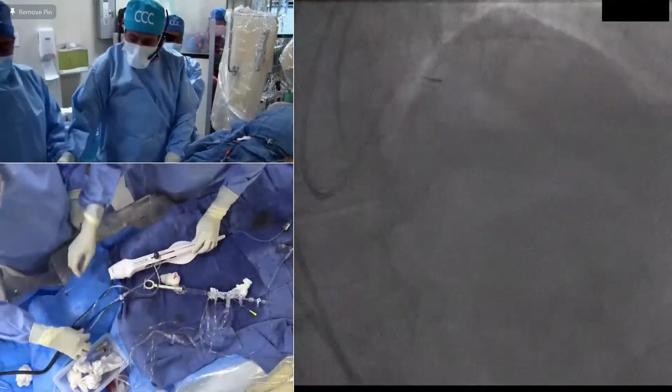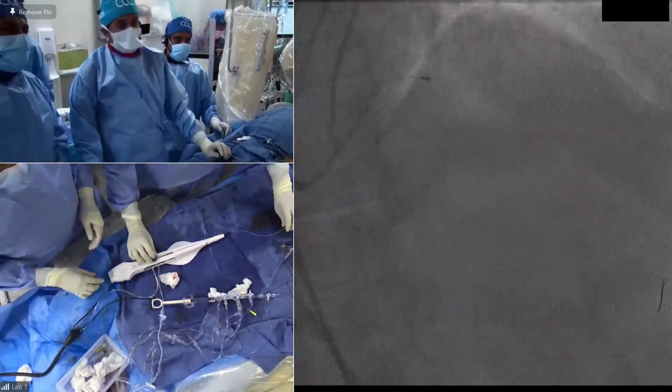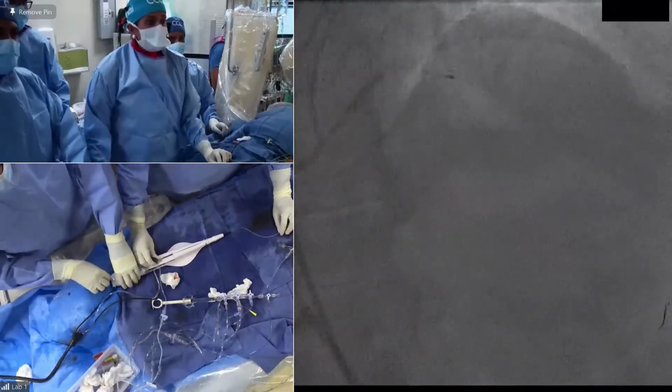Okay. So what we'll do is, once we have it, we'll dyna all the way down there. Okay? Good. Just why not burring? Yeah. We need to burr anyhow. Or start. Okay. You have to pull back the wire a little bit.